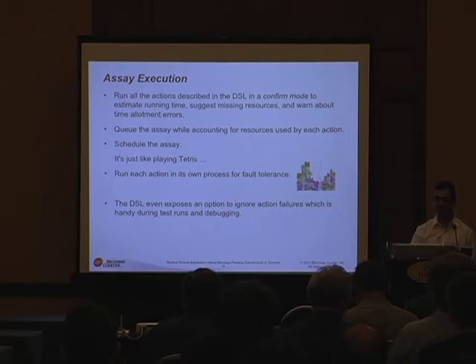This is so that if things go bad or something bad happens, you actually have options now to either ignore failure or say cancel that one particular set of actions or just stop the whole device because it's something catastrophic. But it gives you programmatically options in doing things rather than just have the whole system shut down.